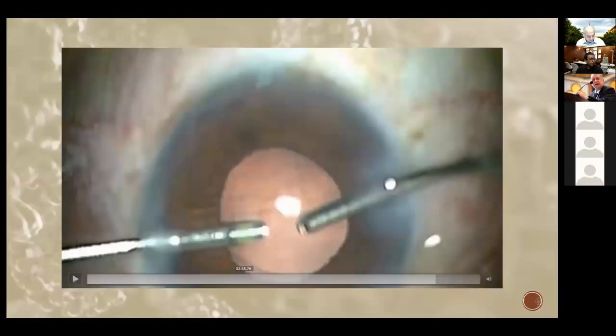Actually, I have one comment, Dr. Yahya. You are an excellent surgeon. One of the best surgeons, and I really admire your work. I only have one question regarding such cases. Why do you prefer to do cataract in combination with DALK, while it's better to do refractive cataract surgery after you remove your sutures and do proper IOL calculation, or it doesn't make a difference?